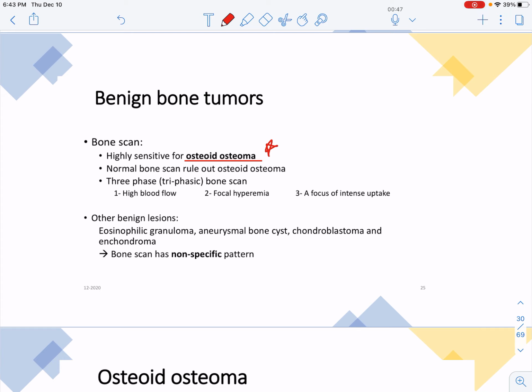لما تشوفوا osteoid osteoma حنعمل 3 phase، حنلاقي high blood flow، وحنلاقي focal hyperemia، وحنلاقي كمان intense uptake بعد الديلي. لما يصير أول ما نحقن المادة المشعة ونبدأ على طول نصور في الفلو حنشوف intense uptake. بعدين بعدها حنشوف كمان في البلاد بولينج في second phase hyperemia، وحنشوف كمان في ال third phase there will be an increased uptake يصير osteoid osteoma.